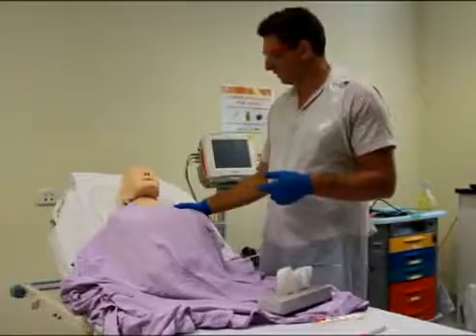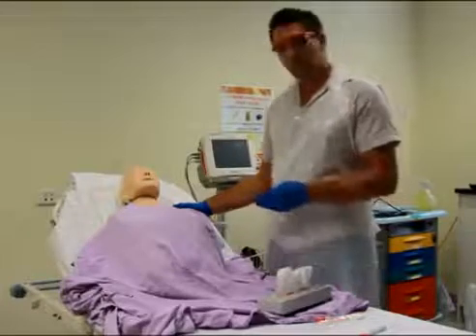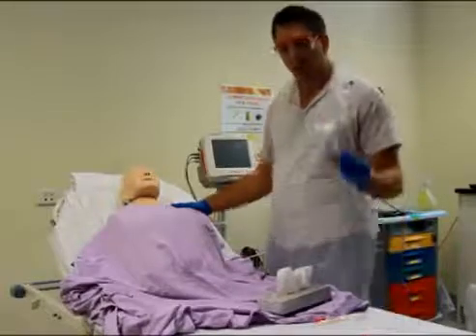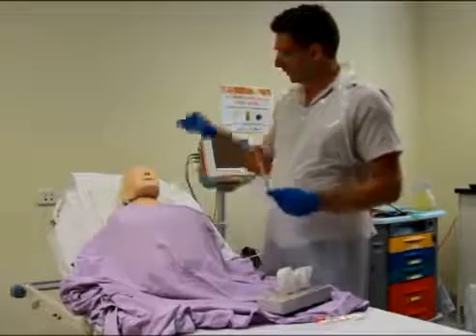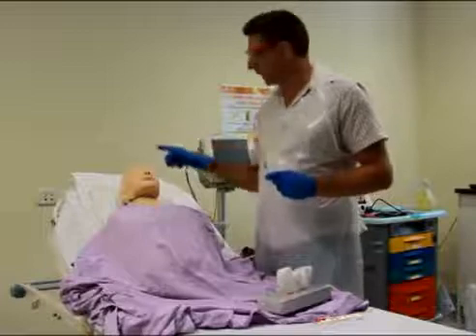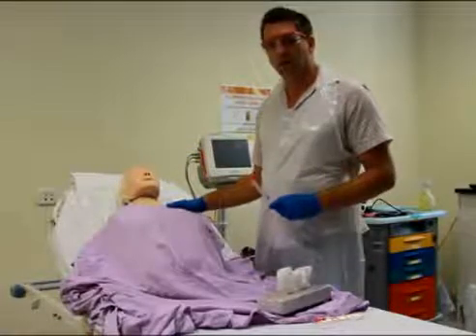Just to recap on what we've done today: we've explained to the patient how we're going to do the swab. Make sure you choose the right swab — either a viral or a bacterial. Make sure you go straight back past the nostrils, don't go up, and always make sure that you reassure the patient after you finish.